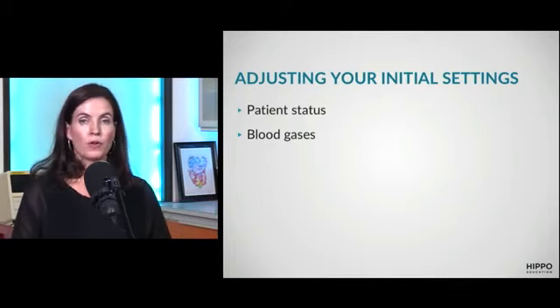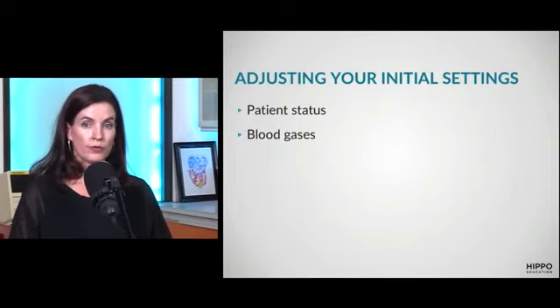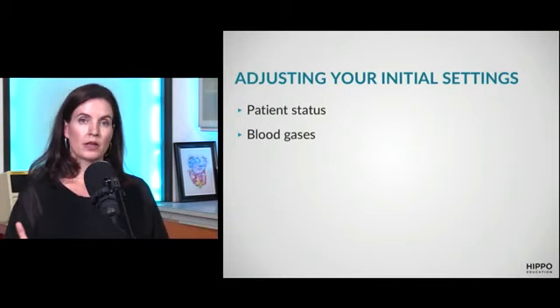Are they comfortable? Is their SAT okay? Do they look air hungry? Maybe you need to turn up the flow. But you want a comfortable patient with decent vital signs lying in the bed.